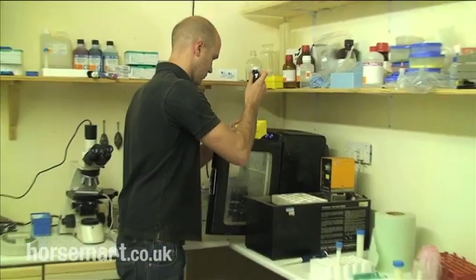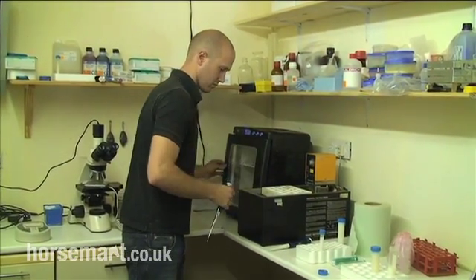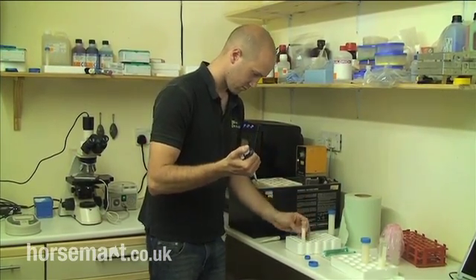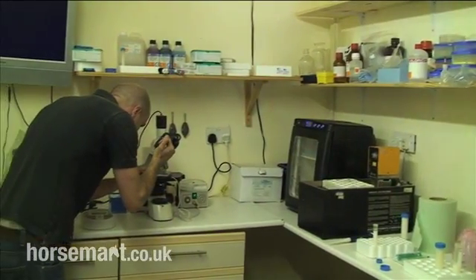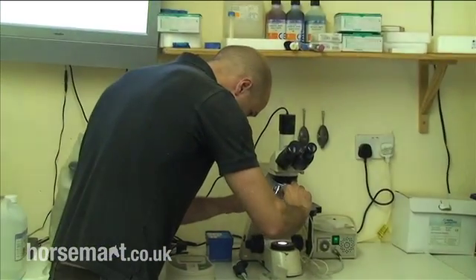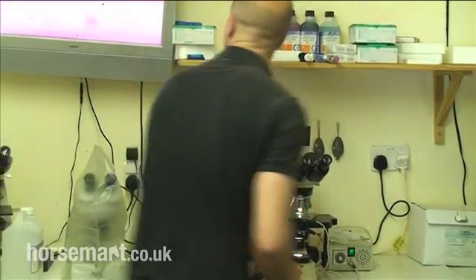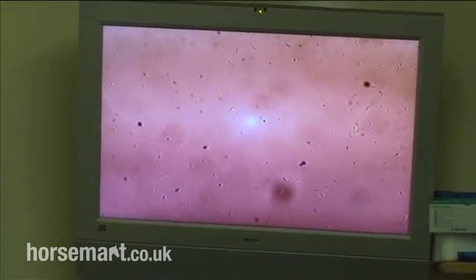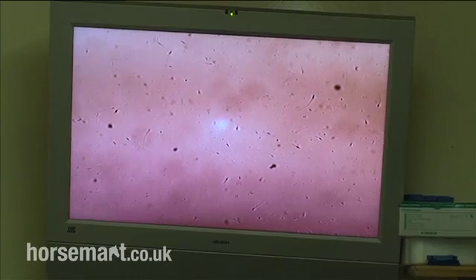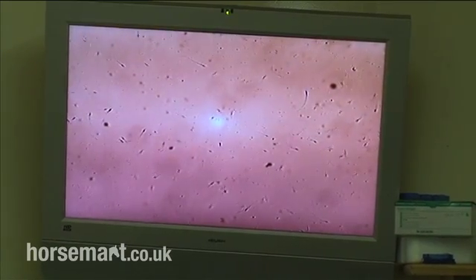Jamie's taken another sample and he's going to look at motility — the actual movement of the sperm underneath the microscope. We'll be able to look at that on the TV monitor as well. He'll be looking to get an idea of the percentage of sperm that are actually traveling in a more or less straight line. There are two forms of motility: overall motility and progressive motility. Overall motility is the percentage of sperm that are moving, including those going forwards, backwards, sideways, and in circles. Those really aren't the ones that are going to get the mares pregnant — it's only the sperm going forward in a straight line that get the job done. We can see here that a fairly good percentage are traveling in a reasonably forward, straight direction, though you can certainly see a few going in circles.